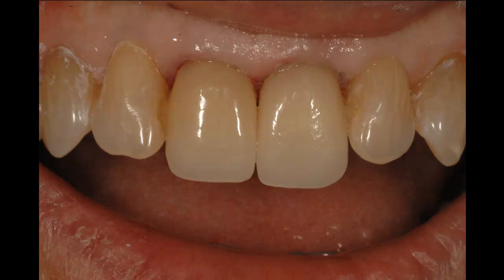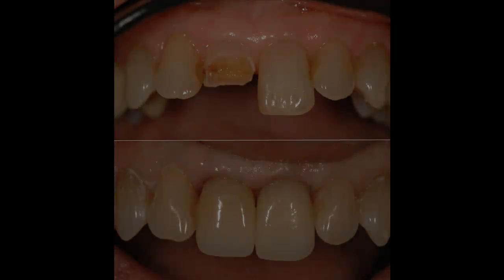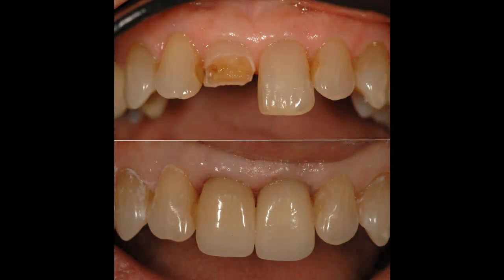So this is the actual post-cementation picture immediately after the cementation of the crowns. As we go back and look at the comparison of the before and after, they look pretty close to what they were. She was delighted, and this was a great case to have to work into the schedule. Productivity was up, of course. Add a couple of crowns there to our schedule, and payment. She paid in full for the services, and we love that too.